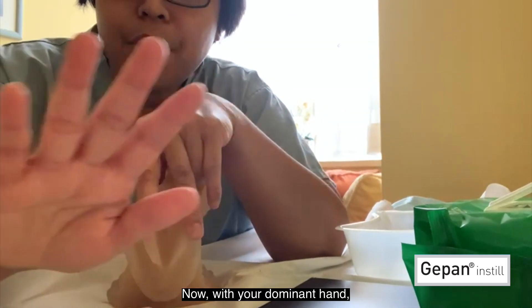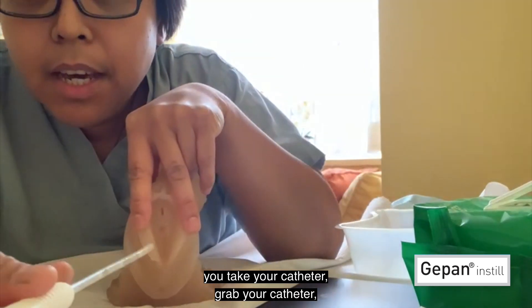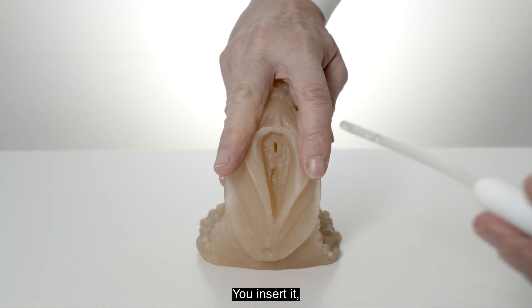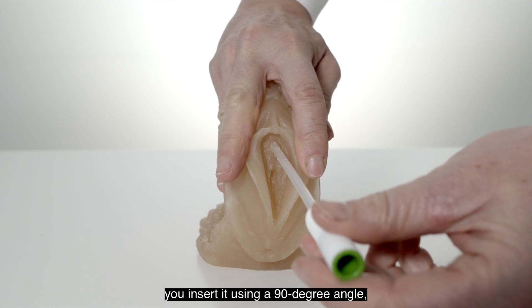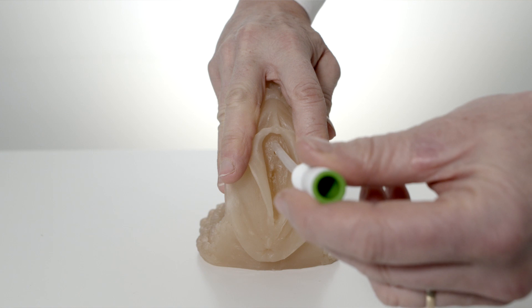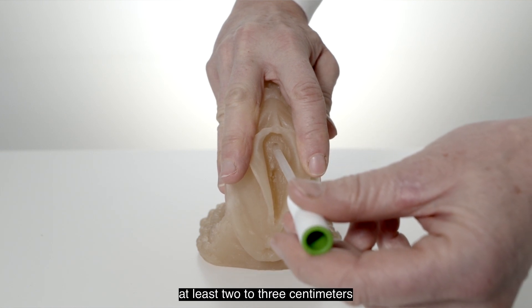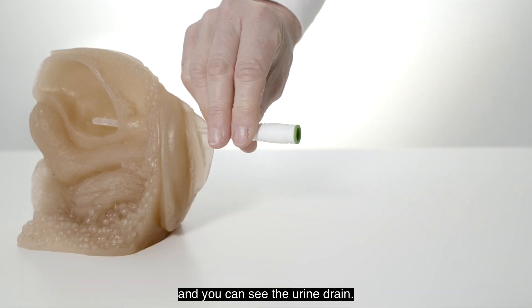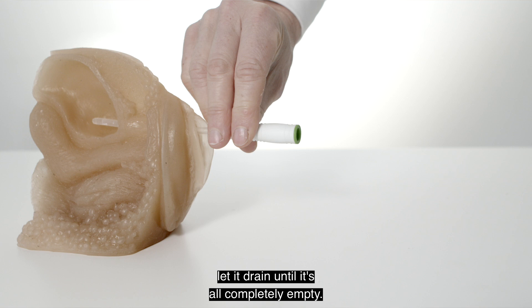With your dominant hand, take your catheter, grab it and aim into the urethra. Insert it at a 90-degree angle, slowly advancing the catheter at least two to three centimeters until it reaches the bladder and you can see the urine drain.